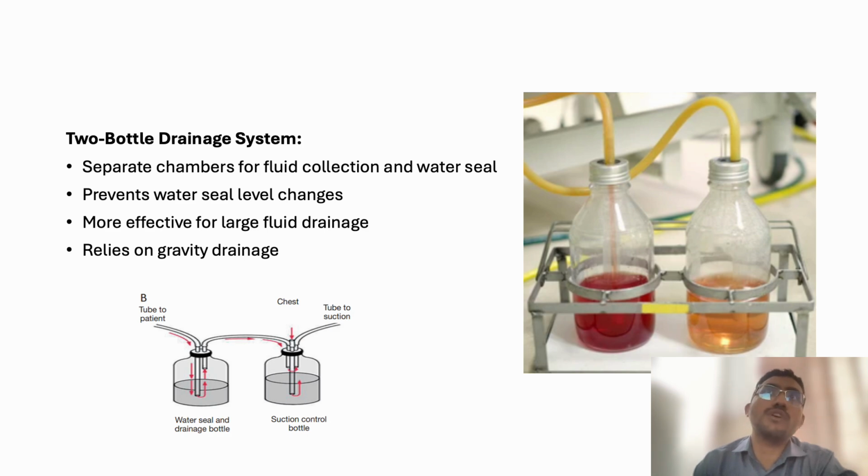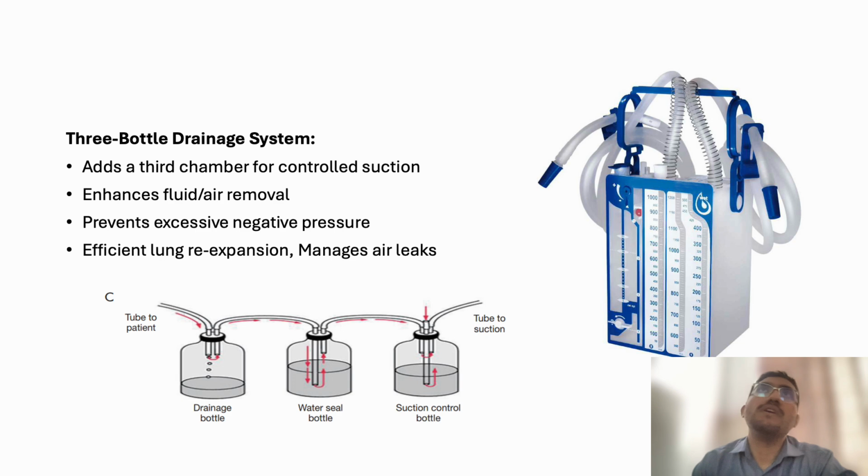And of course, we can use a controlled suction, which is not very possible in the single bottle drainage system. Then there is a 3 bottle drainage system.